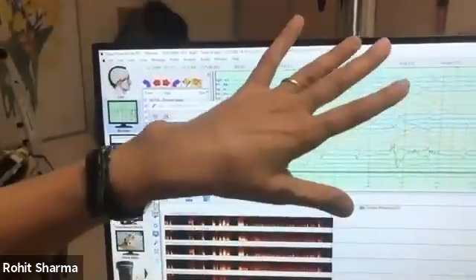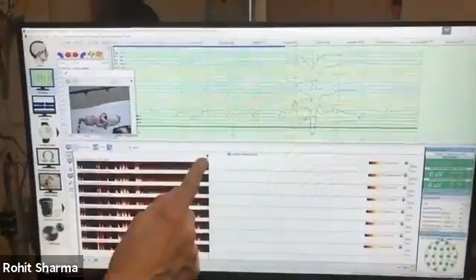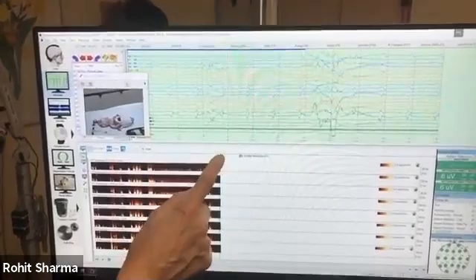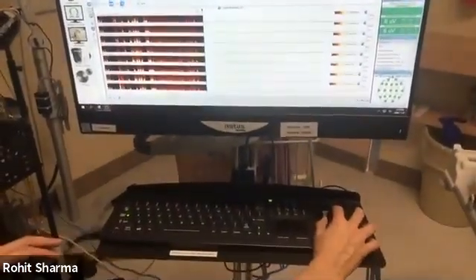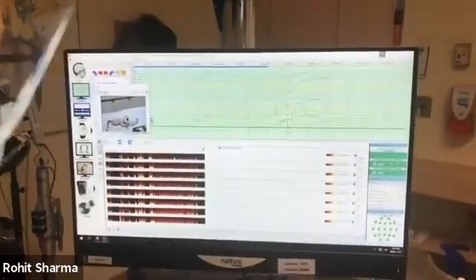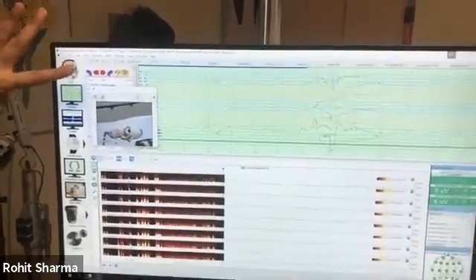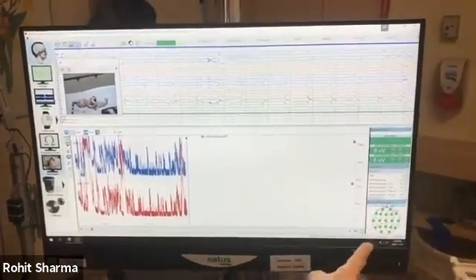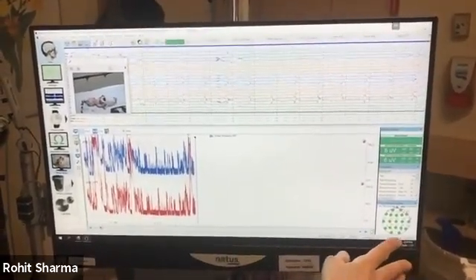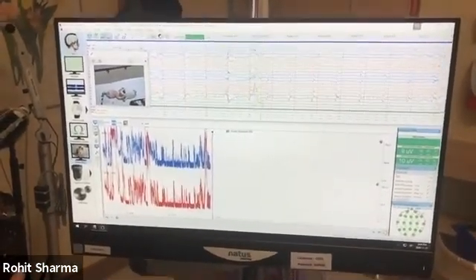If you notice, the screen color has now become green and you have the CFM underneath here. You can move the CFM marker to where you would like to go. You can use the mouse or the cursor to move it, and you can go back and look at the EEG tracing. When you're done, you can come right back to the live recording. At the bottom right-hand corner, it shows the integrity of the electrodes placed on the patient's head. You don't need to worry about the rest of this stuff because that's what concerns us more.